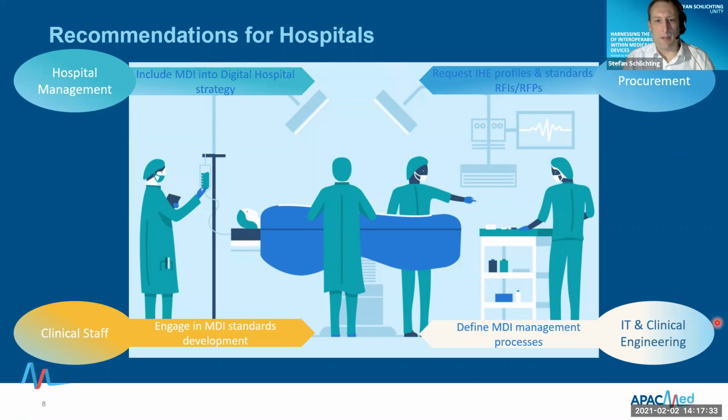Then, of course, we do have below here the IT and clinical engineering staff. I think for this group that really helps to run and operate all these technologies, and that makes it possible that these scenarios really can come to life, it's highly important that, if they haven't started yet, they define a management process to handle interoperable medical device systems.